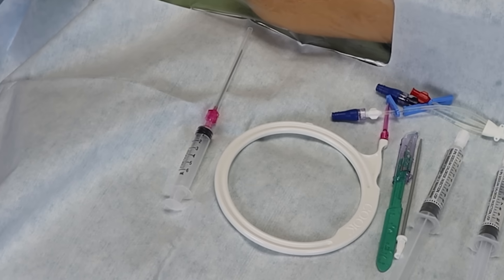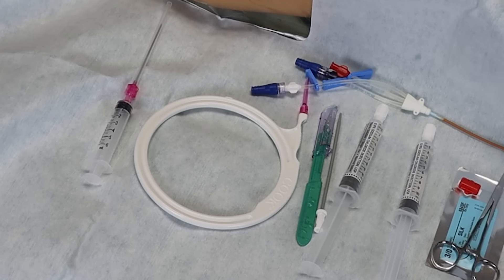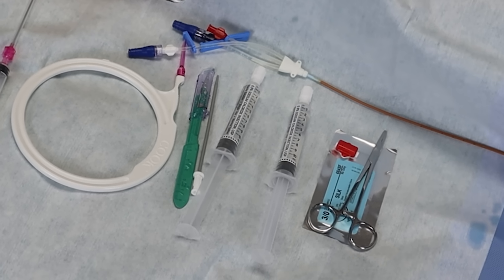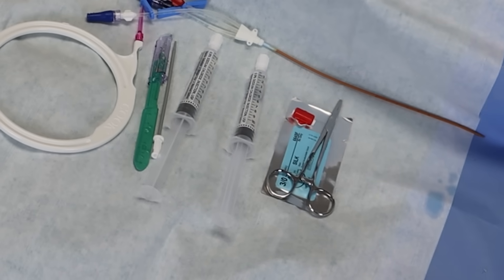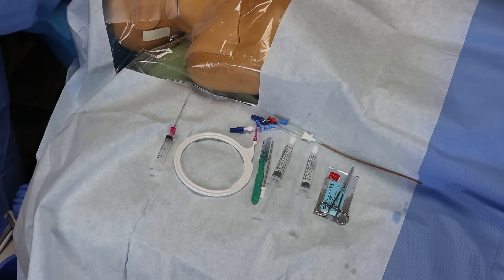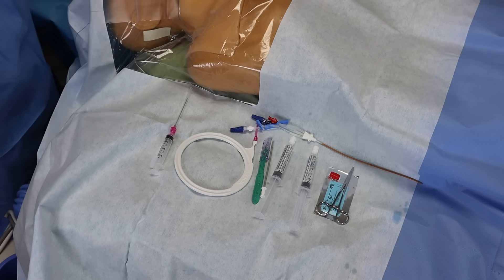Number two, especially if you don't have an assistant, the tool you need next will always be the one coming up. The order should be: the finder needle attached to the syringe, the guide wire, a knife, the dilator, the catheter, saline flushes, and then finally the things you need to sew it in — the needle driver, the suture, and the catheter fastener. I really like staging on the sterile field itself next to the patient. It leaves the tools within arm's reach and I don't have to look away to grab them. The Mayo stand will be just fine too, especially if the patient is squirrely and you're afraid they may bump your equipment.